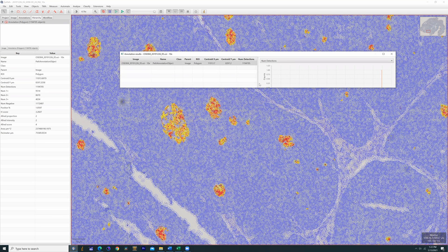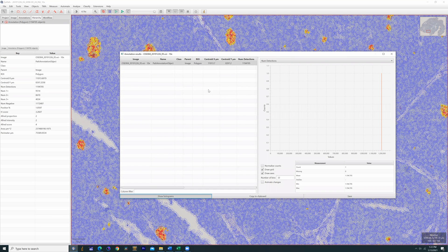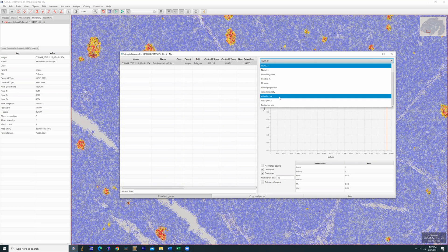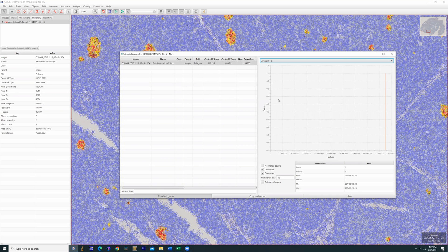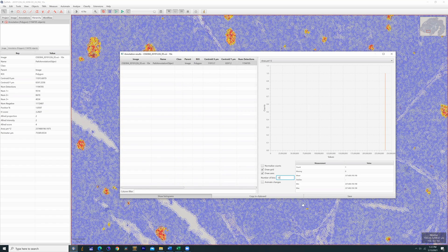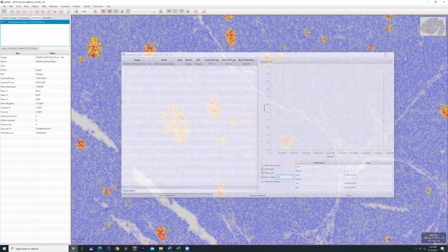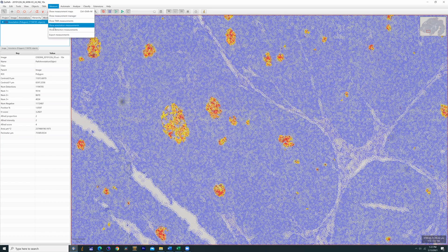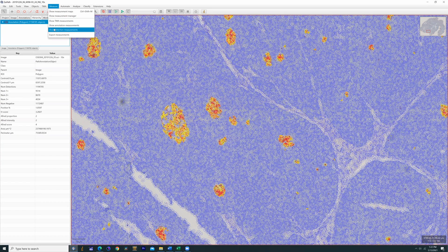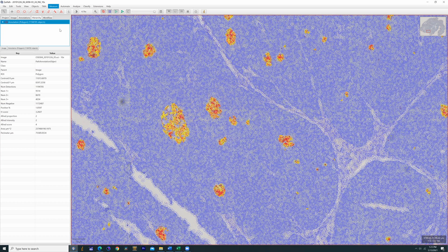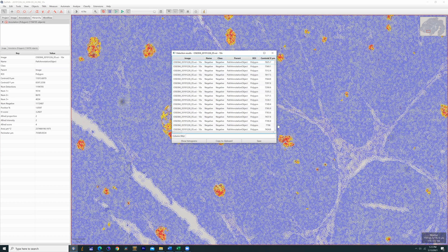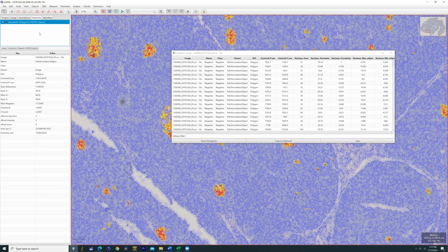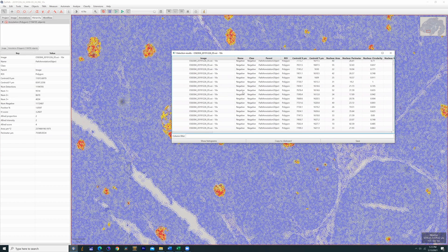You could obviously copy this to a clipboard and save it into your document. Within each of these tabs there's actually a second choice where you can actually plot the data that's buried within the tab. In this case it's only one column, so not terribly interesting, but there's a number of options. So let's say you want to do plots of, let's find something more fun. How about area? And it'll plot your data and you can control the number of demarcations. In this case, like I said, not so exciting because it's only one data point.